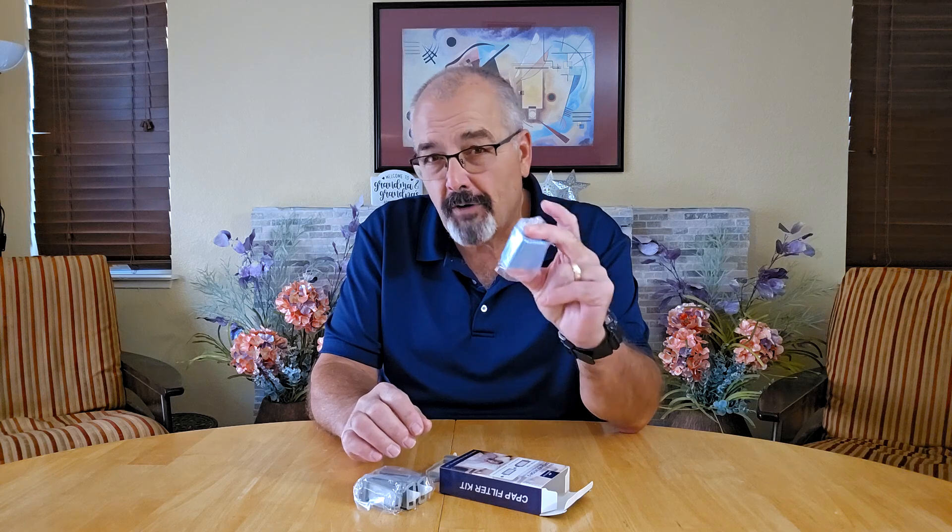This pack includes 18 filters total: 6 reusable pollen filters and 12 disposable ultrafine filters, all designed to keep your CPAP running smooth and delivering fresh, clean air every night. What I really like about the system is the variety it offers.